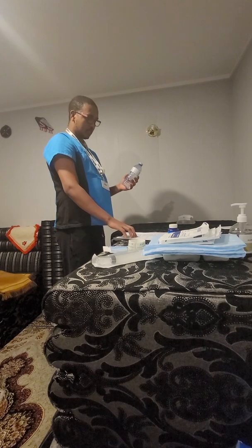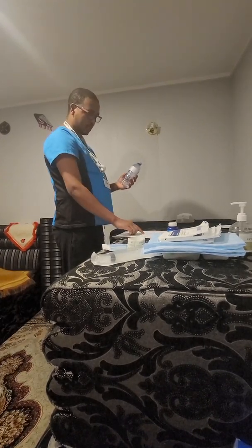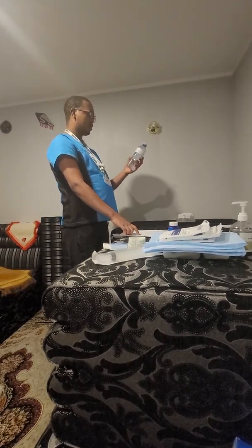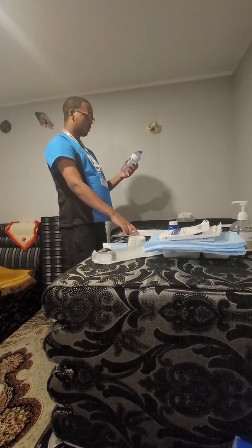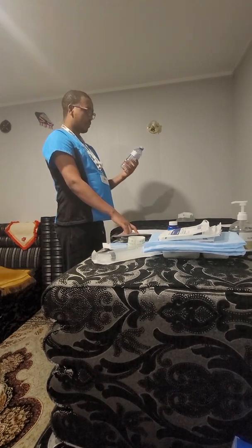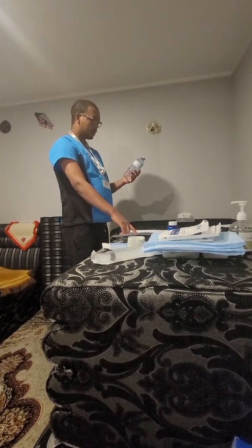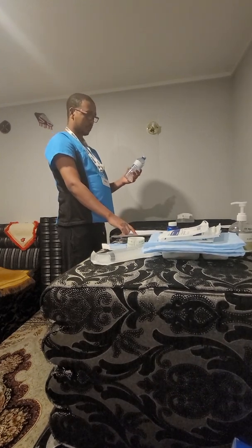My third check. Patient name is Steven Deep, date of birth 1980, November 29. Action irrigate abdominal wound with 0.9% sodium chloride. No patient information. In my hand I have 0.9% sodium chloride. Expired date January 21st. Opened today at 7 a.m. in the morning, which is good to use, and I'm going to use it to irrigate the abdominal wound of Mr. Deep until it runs clean, and to soak the steri strips.